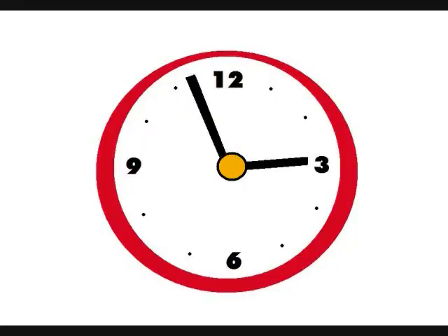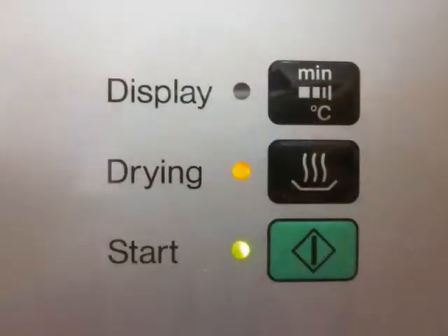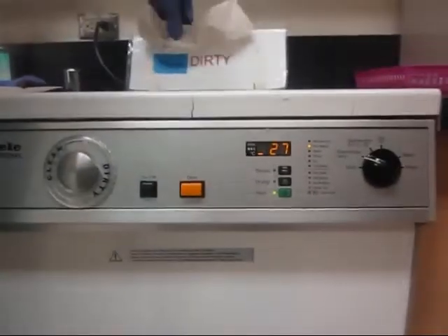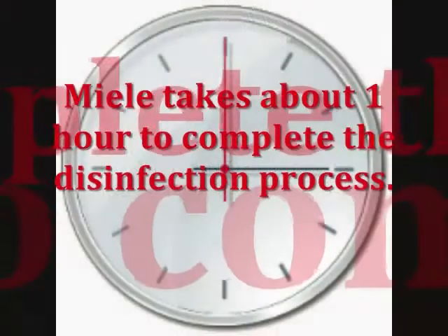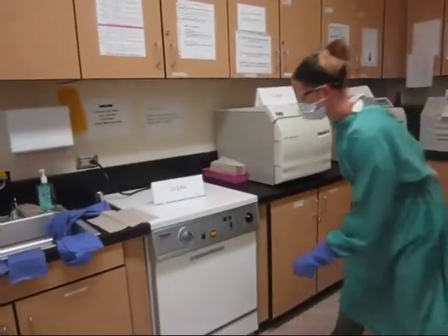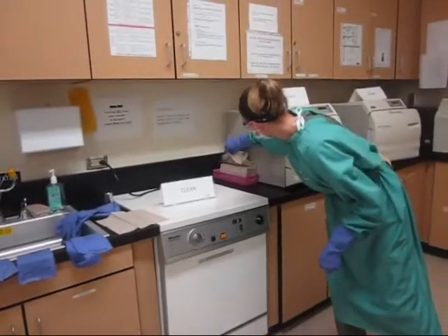She checks the clock — it's 2:57. Looks like she's just in time to start a cycle. Nadine pushes the green button and flips the sign to clean. And the magic begins. Please do not turn off the Miele in the middle of a cycle because the door won't open. When the Miele finishes, Nadine cracks the door open a few inches for cooling.